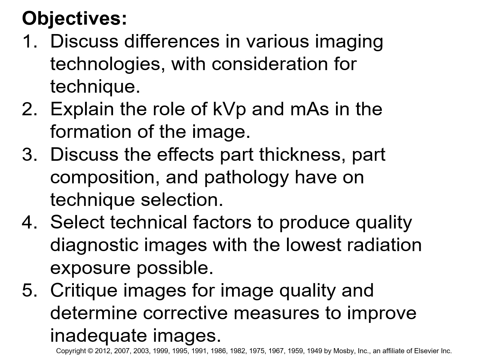What has continued to improve is how do we catch the X radiation, and the device that we call the image receptor used to be screen film technology, physical pieces of film that we would have to develop and process. But now we've created an electronic mechanism, either direct or indirectly, of capturing the X radiation.